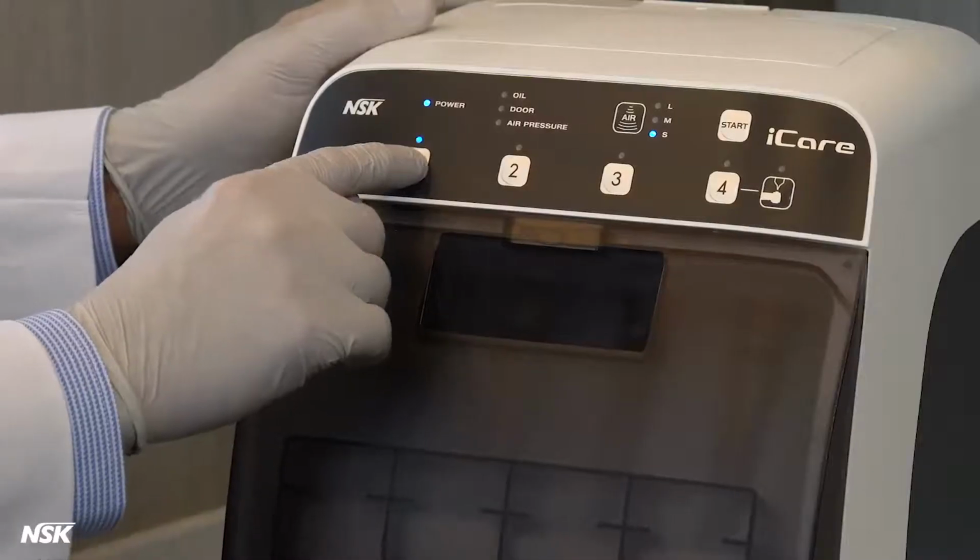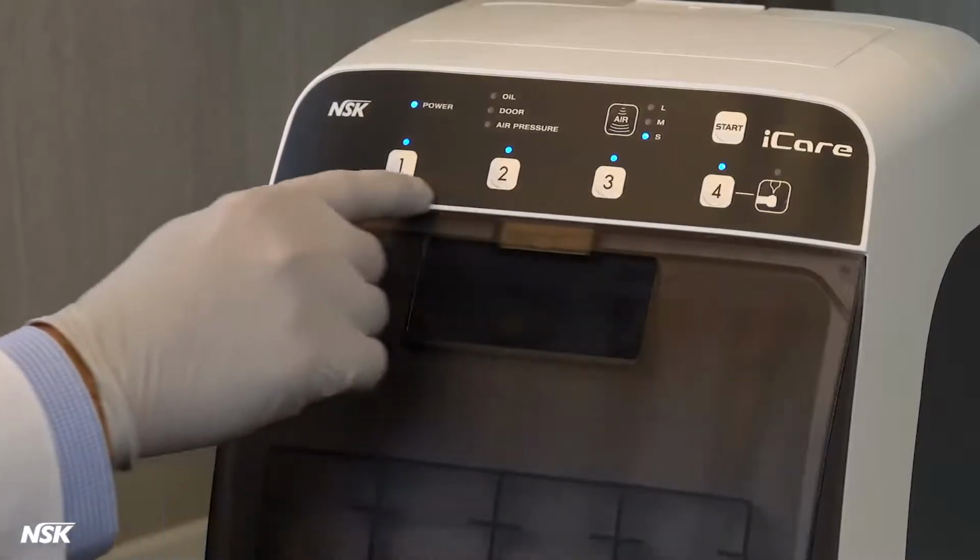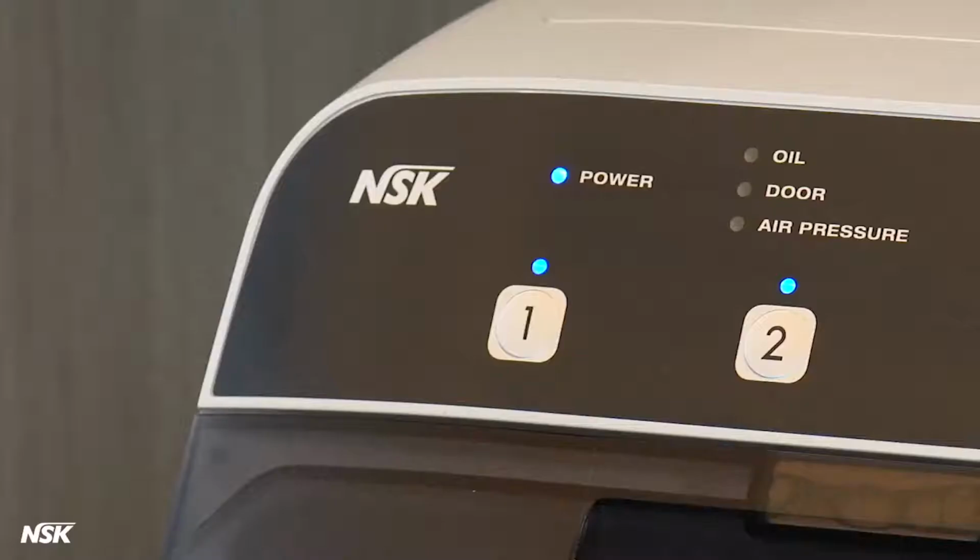In this case, we will select all 4 ports. Then press the start button. This will start the lubricating and cleaning process. You will notice the port is working by the blinking light. iCare cleans 1 handpiece at a time.